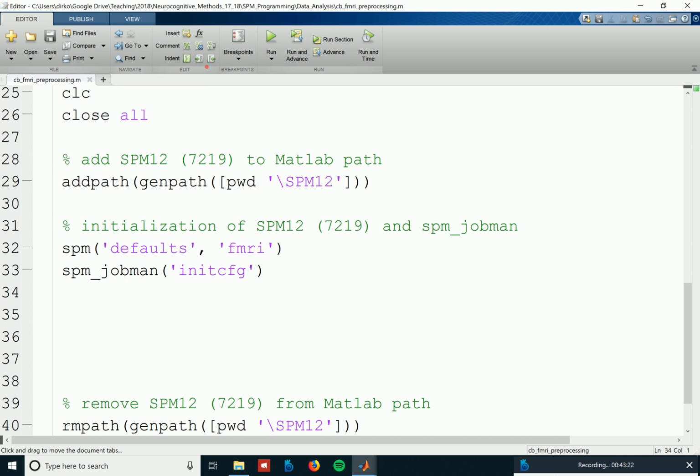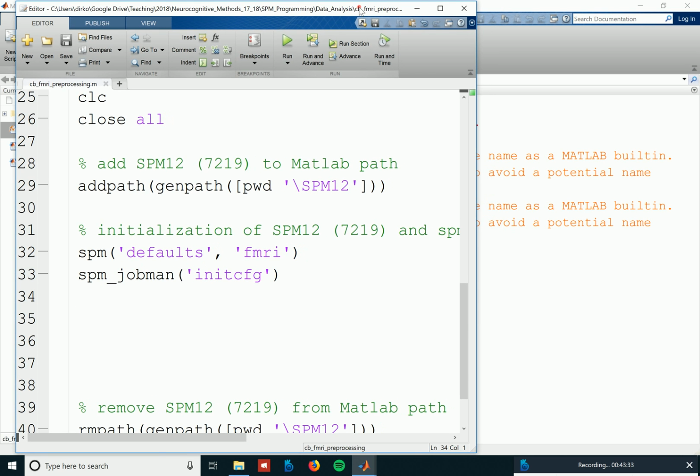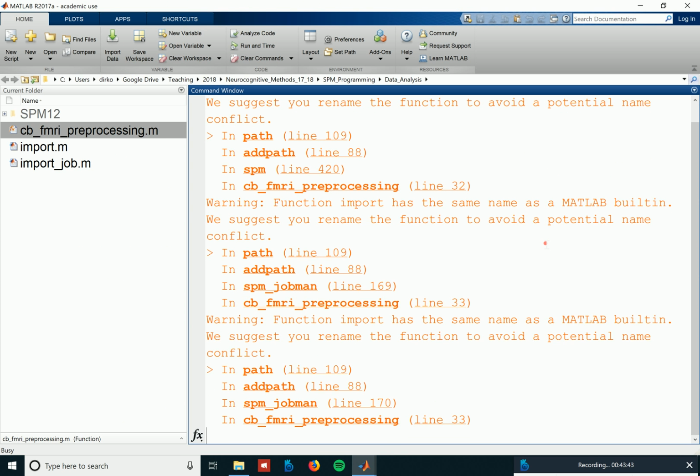So these two things are not really crucial, but you always get the warning by SPM that it wants you to first run this, and then, well, you do what people tell you. If your cats tell you they need food now, then you give them food. And if MATLAB tells you you have to do this, you also do. You have to do everything that people tell you.